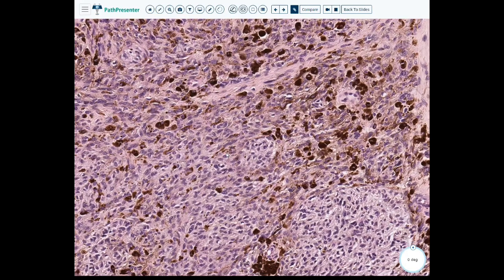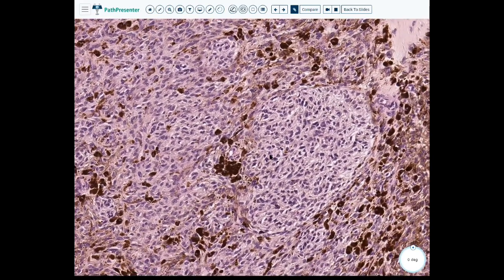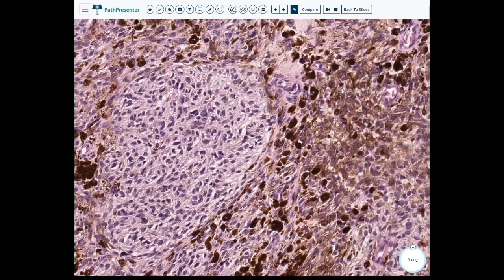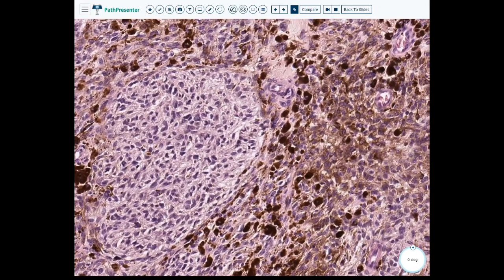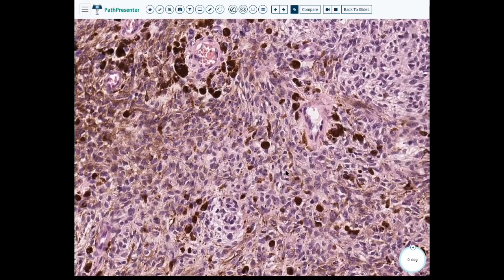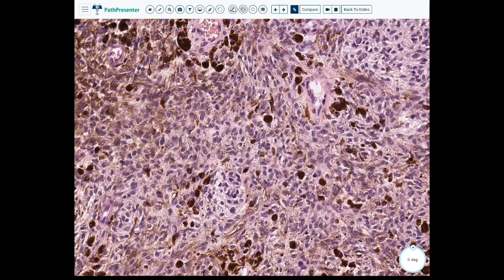And then we have these somewhat elongated or spindled cells that look a little different, maybe from the melanocytes we've seen in other lesions, but they're still relatively bland. A little more variation in shapes. Trying to see if we can see any that, maybe this one, the elongated dendritic processes.